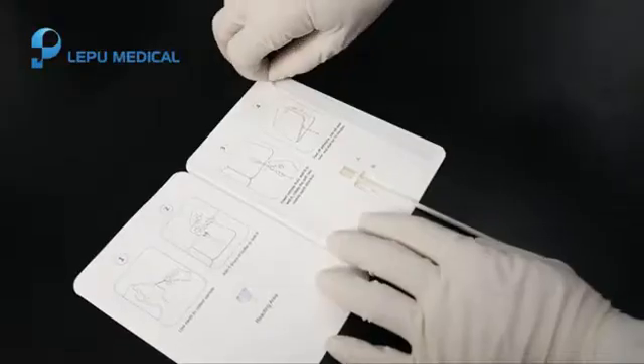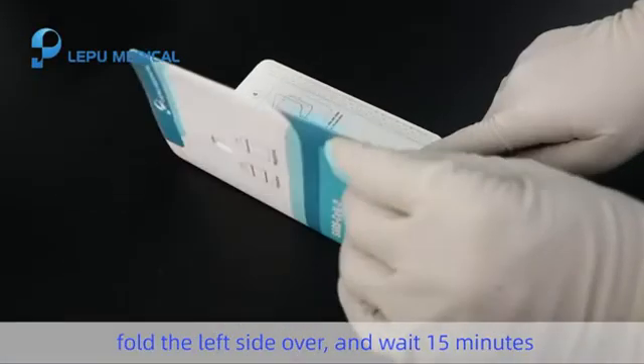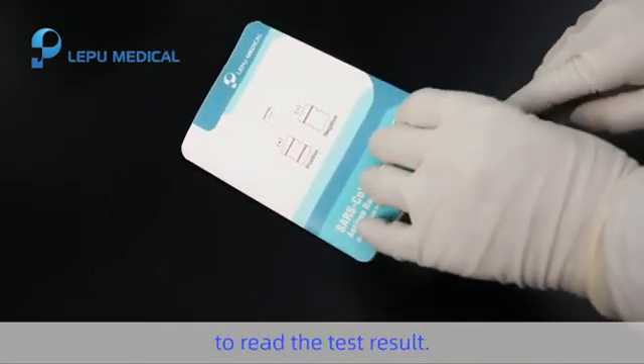Step 5. Peel off the adhesive, fold the left side over, and wait 15 minutes to read the test result.